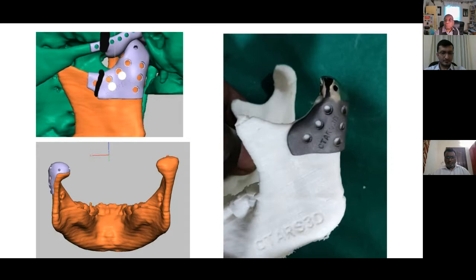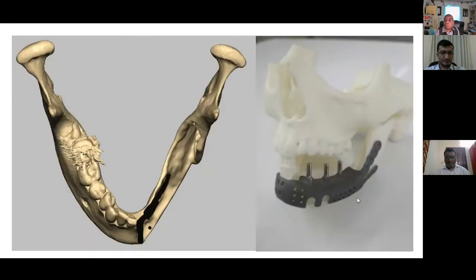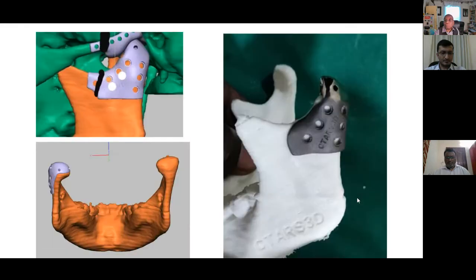But here we have a case wherein it was only one side, and we could see a lot of degenerative changes. There was a previous attempt by someone else to do a discal repair, but it was still progressing. So I discussed this with John sir, and he gave a plan, okay, fine, we could minimize. This was the only case I remember which took only 2.5 to 3 hours of discussion, whereas the rest were hardly less than an hour to discuss with him.